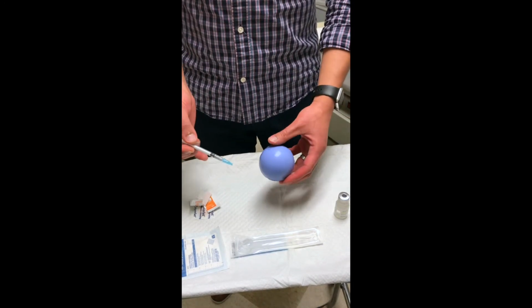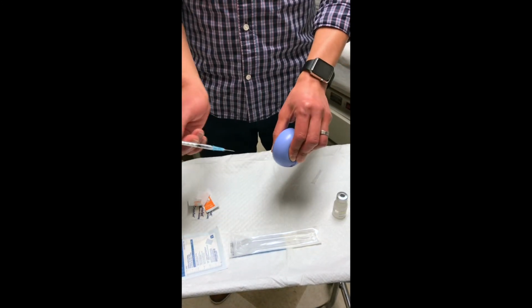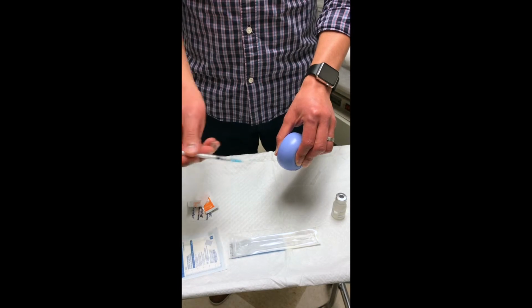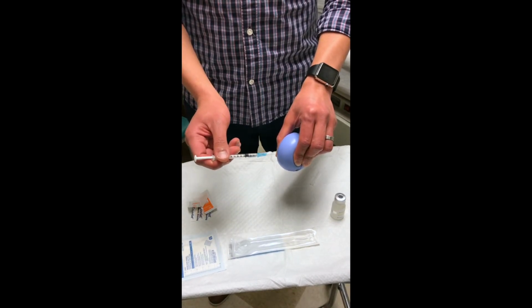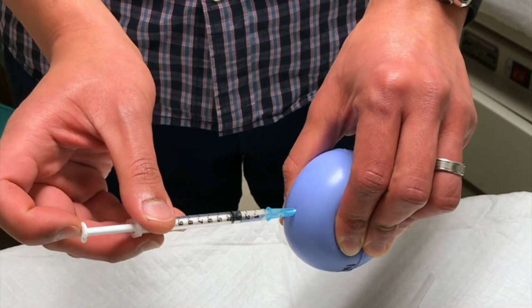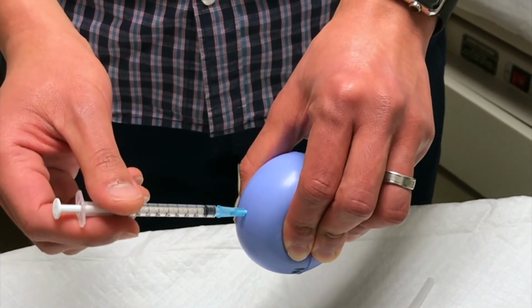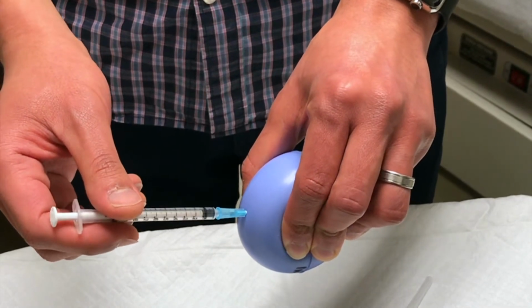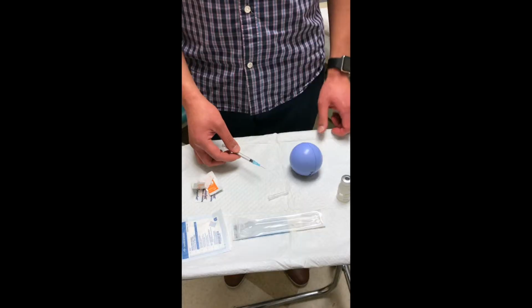And what I like to do is to pinch. Pinching sometimes is helpful and distracting. And I like to go with a darting motion. That way it goes in really fairly quickly. So if I was injecting, I would go, and then once that's in, you then inject. It's okay to go all the way in, and it's actually a good idea to go all the way in. And once you're done, just pull straight back, and that's it.